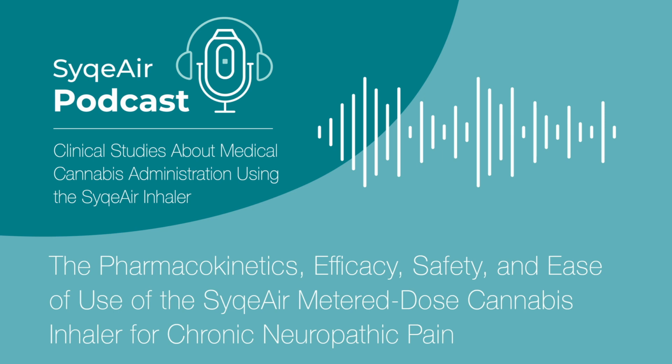That's pretty amazing. But what about consistency? Was the dose all over the place like with smoking? Or did the inhaler deliver a predictable amount of THC each time? That's where it gets really interesting. The study found that the SyqeAir Inhaler caused much less variation in THC levels between people compared to other methods, like smoking or vaporizers. So if you and I use the inhaler, we'd probably have similar levels of THC in our blood, even if we have different tolerances.